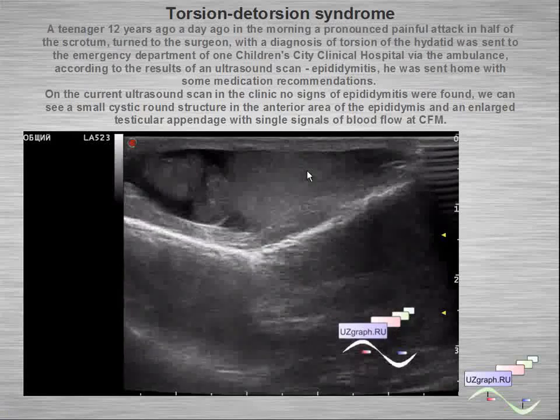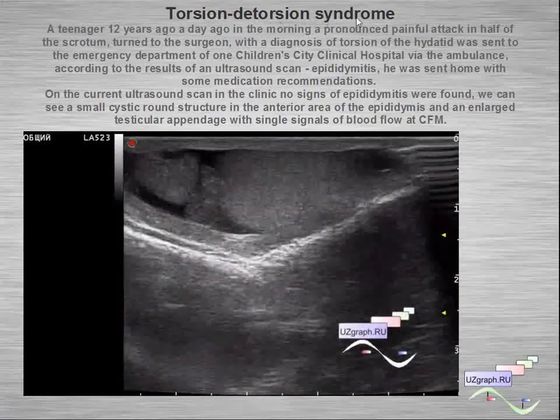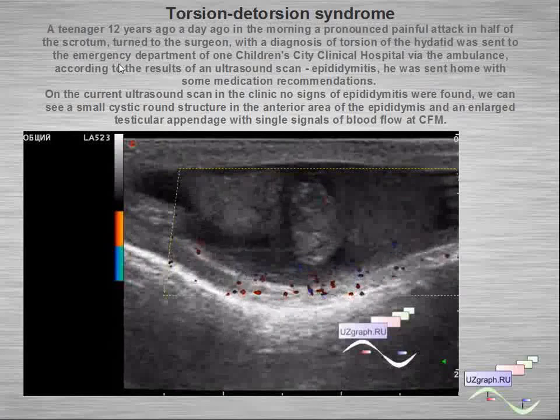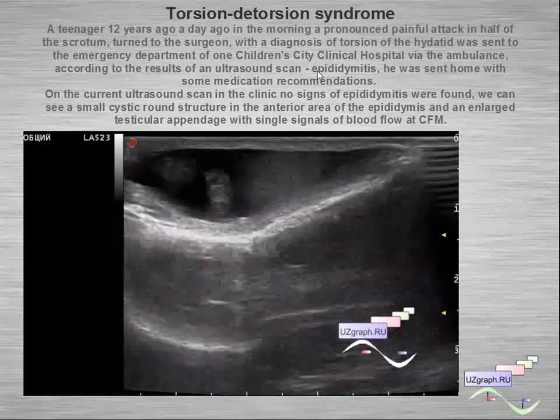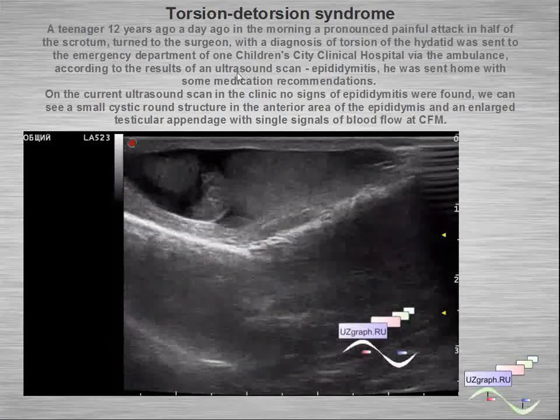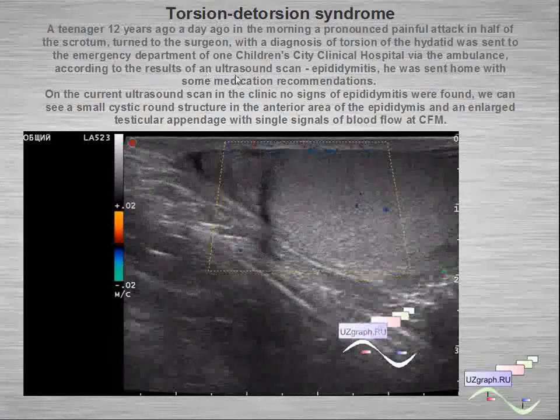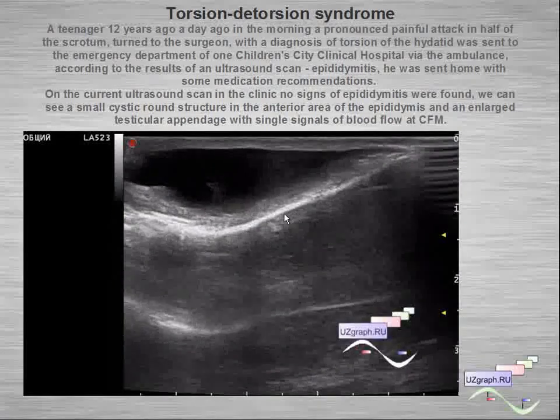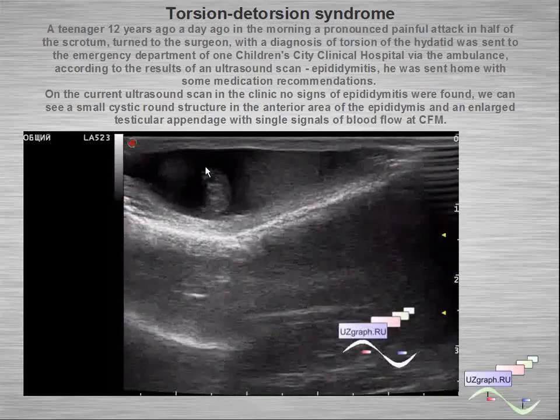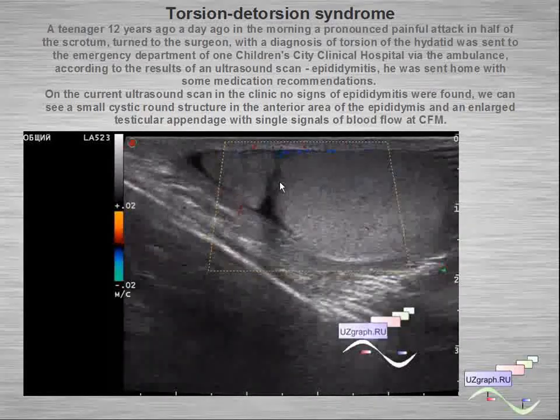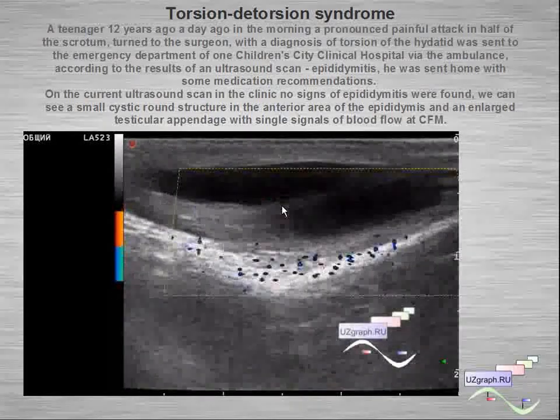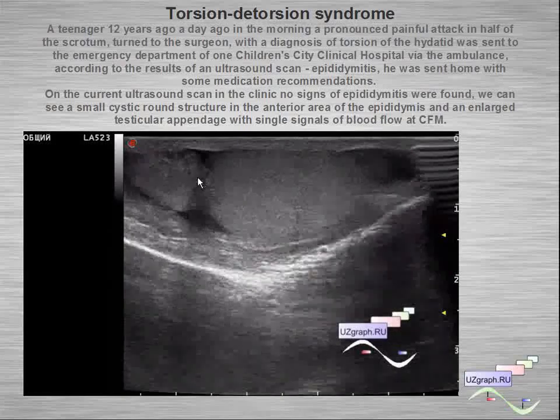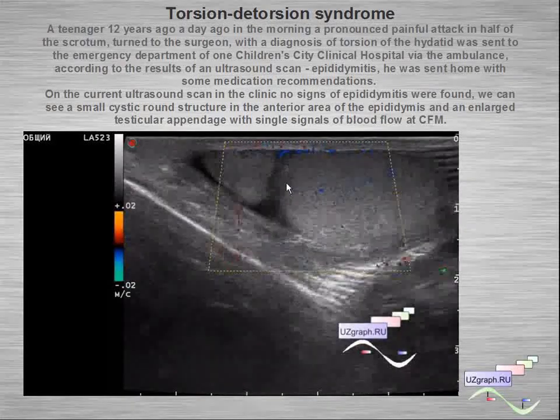Another example: torsion-detorsion syndrome of the hydatid — testicular appendage. This case is notable because of misdiagnosis. It was initially diagnosed as epididymitis, but at a second-look ultrasound, I found an enlarged appendage with blood flow at color flow mode — this is the detorsion phase of torsion-detorsion syndrome of the testicular appendage.